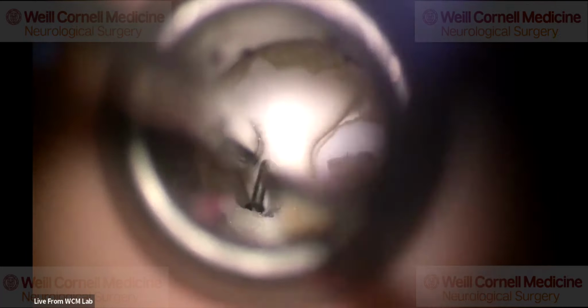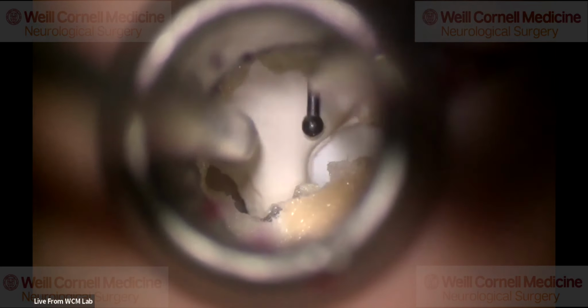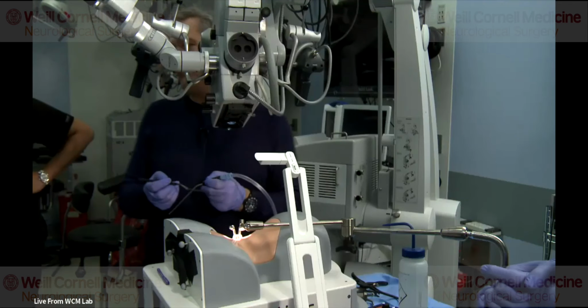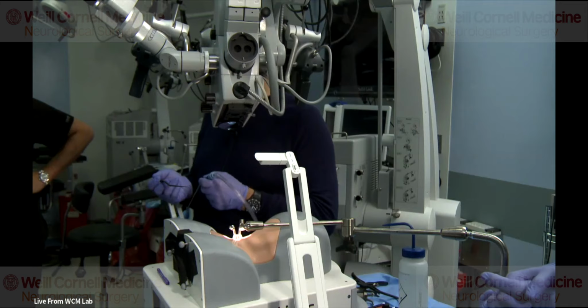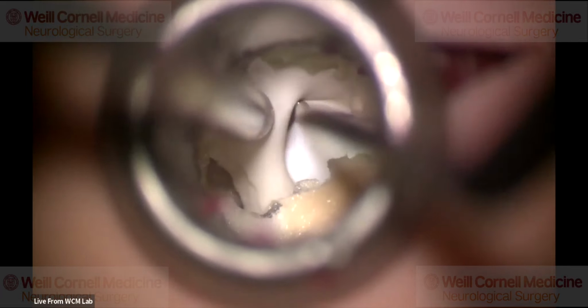Again, in a real case, remember that you don't see that nerve. This is all covered with veins. And then at some point, you've got to make a decision. Are you going to go through the veins, or are you happy, if somebody just has bony foraminal stenosis, you may leave the veins there. You may just get a decompression. But if somebody actually has a herniated disc, which typically would be at the caudal end, like here, then obviously you've got to look for that disc, and then you would move the nerve root up.